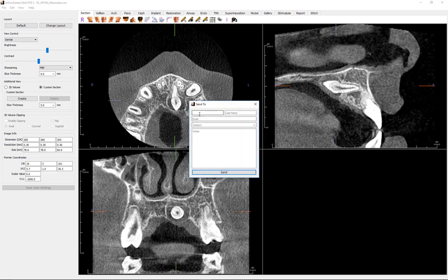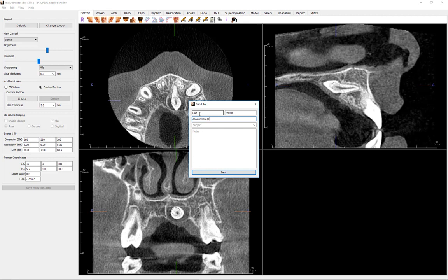After logging in, the user can input the recipient's name, email, message subject, and notes. This information and the link to accessing the case will be sent to the recipient's email.